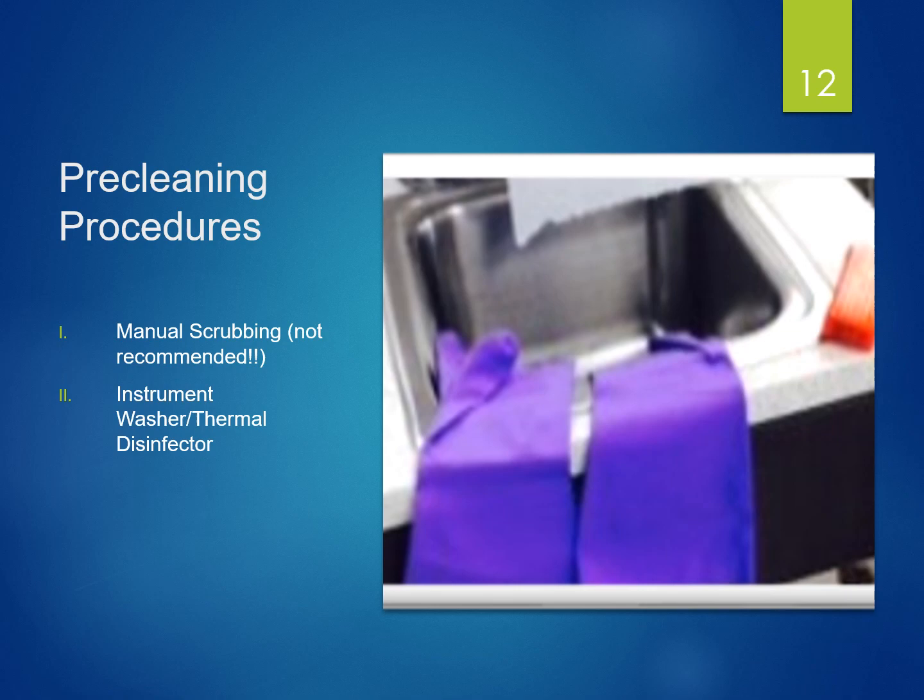Manual scrubbing for instrument processing is not recommended. Occasionally you may have to do that, but again, it is not recommended to manually scrub our instruments unless it's extremely necessary. We're either going to run them through the instrument washer, which is in our central sterilization area. Some offices have this big dishwasher, or they're going to be run through an ultrasonic in some of your dental offices.